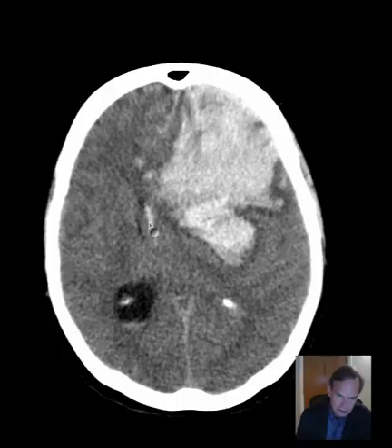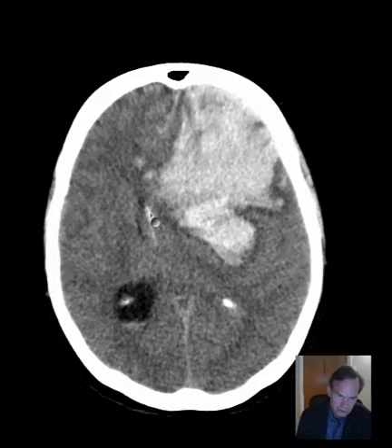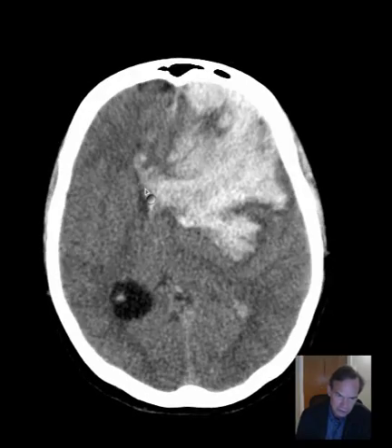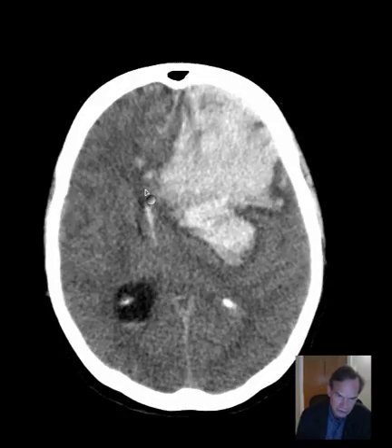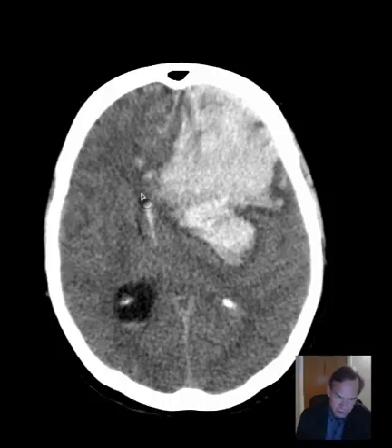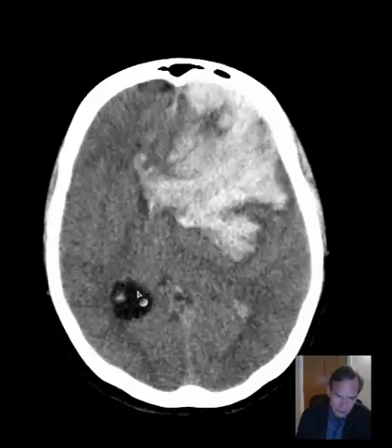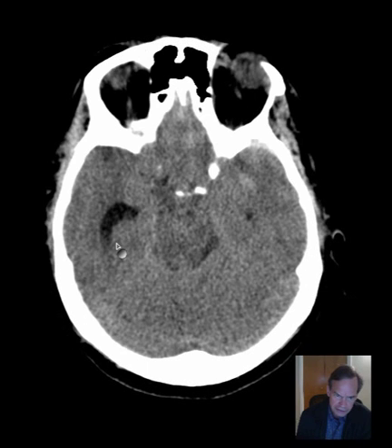This little slit that has blood in it is probably the third ventricle, and so either the connection from the right lateral ventricle to the third ventricle, or the third ventricle itself, or both, are locations of the obstruction that's causing this right lateral ventricle to dilate.